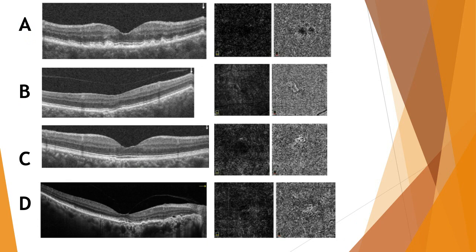A had these soft confluent drusen on the B scan, which show up, again, as choroidal shadowing due to blocking of the signal, but no evidence of CNV. B has what we call choroidal excavation. I was never expecting that patient to have a membrane, and you can see they have a little baby membrane on the choriocapillaris slab. Patient C is the one I already shared with you. You can see the membrane. And then patient D had a really thick RPE. It's attenuated, it's irregular, it's mottled, and that patient had a little baby CNV as well.